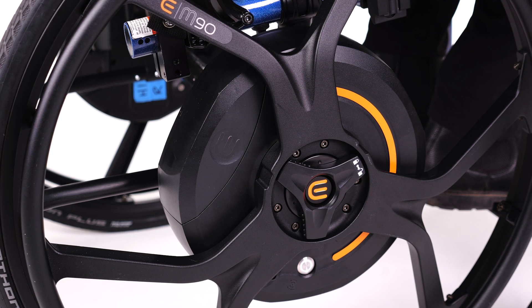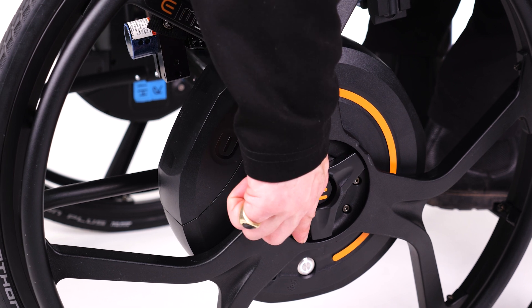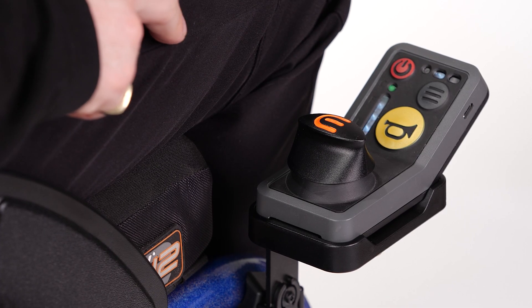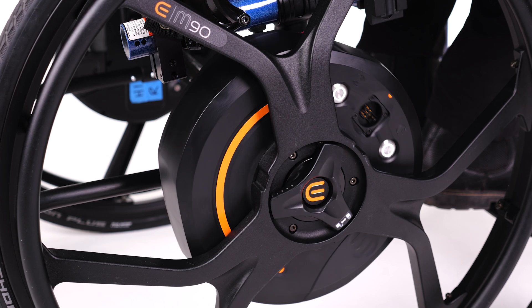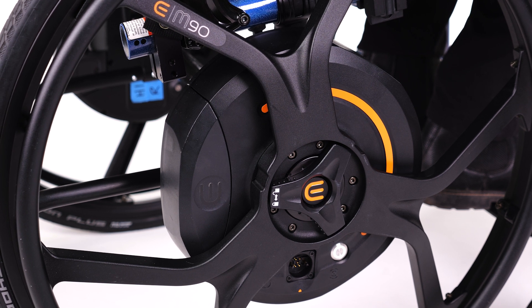To drive the M90, first we need to engage the wheels. To do this while seated in the chair, reach down and rotate the engagement switch by pushing on the raised bumps on the side. Once the engagement switch is in place, hold either the all-way toggle or speed controller toggle forward. The hubs will rotate and lock into place, and both wheels will give an audible and physical click once they are engaged.